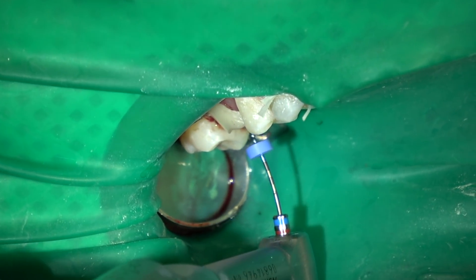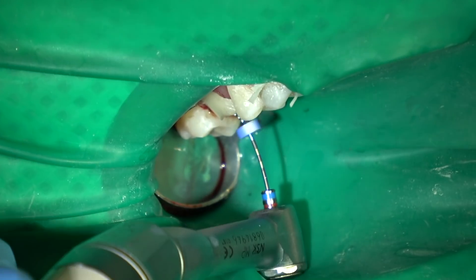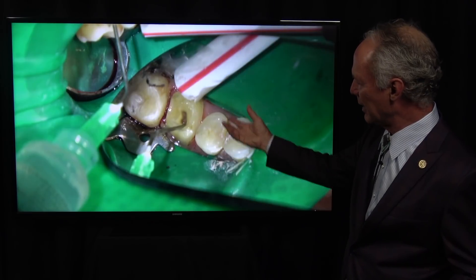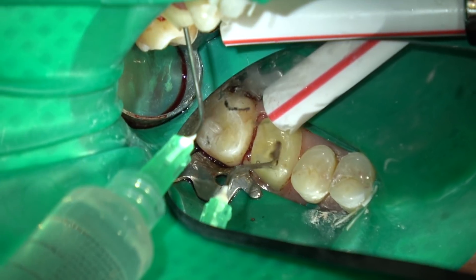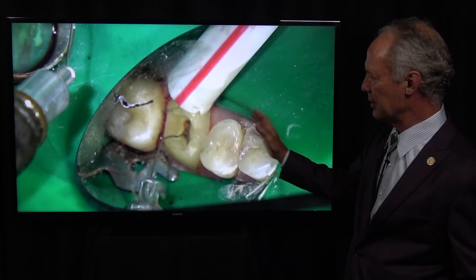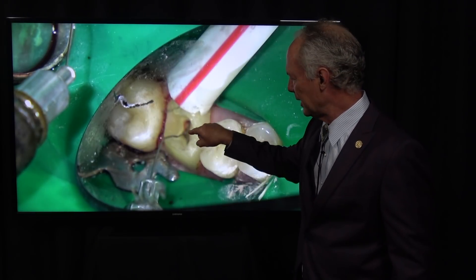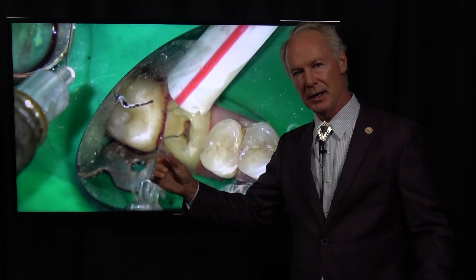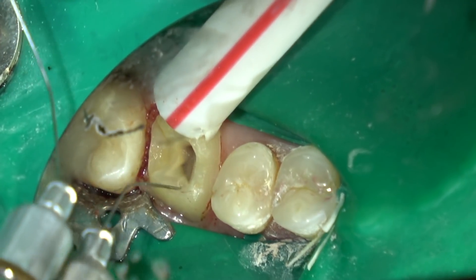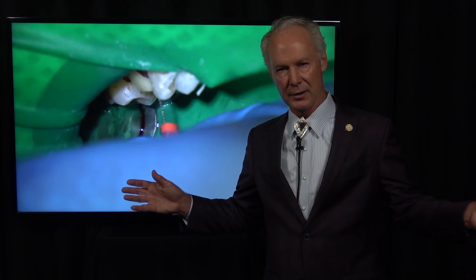If it binds and you can't go in, go back with your Hedstrom hand file and open it up a little bit more. Just go in, let it bite, then pull it out — each time you'll go a little further. Do that 10 or 15 times in each canal and you'll clean them out beautifully. Then irrigate. I'm using a local anesthetic syringe here only because it has a 30-gauge needle that fits the canal perfectly — I'm not placing it under pressure, just at the coronal part of the canal, floating any debris up to the pulp chamber to clean it out. You could use water — it's just that the 30-gauge needle is perfect for irrigating.